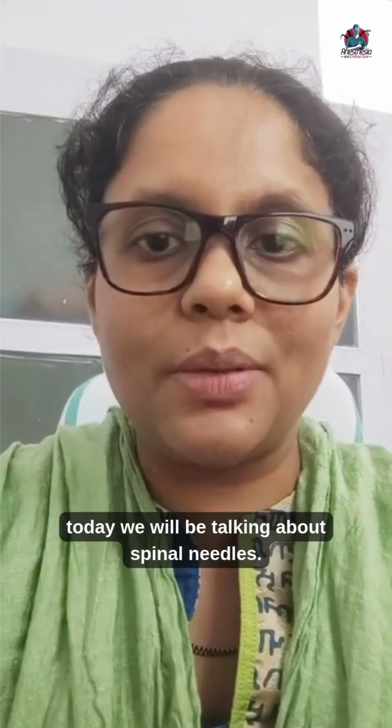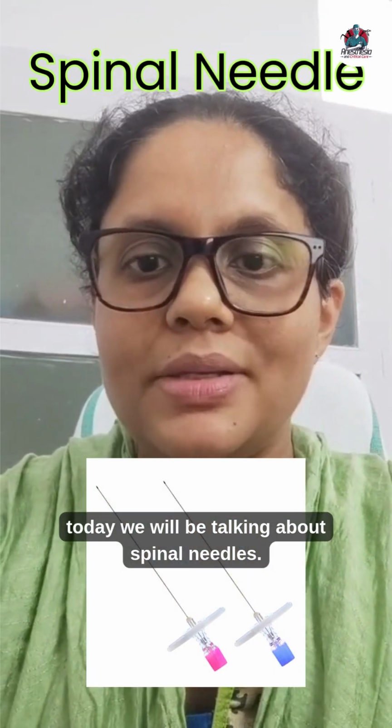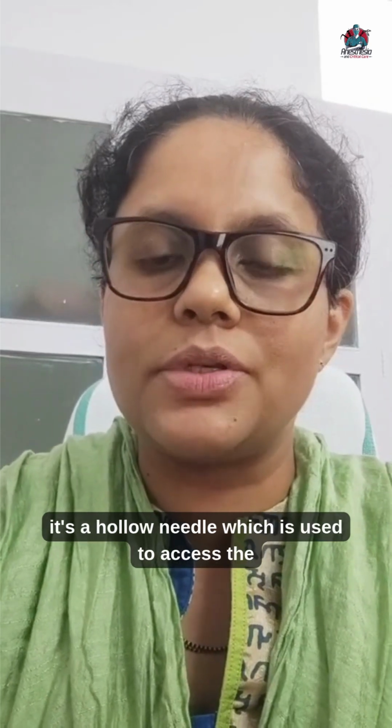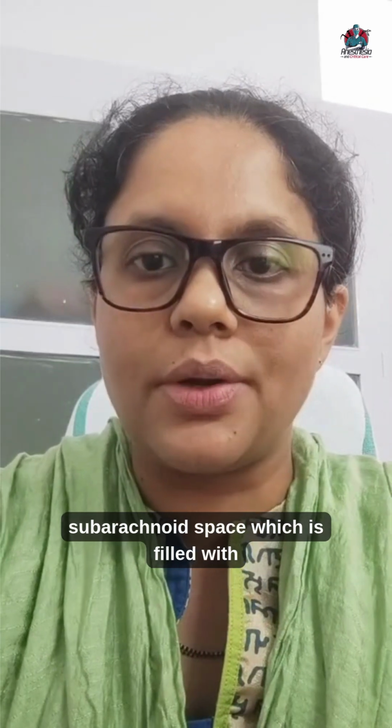Good morning. Today we'll be talking about spinal needles. Spinal needle definition: it's a hollow needle which is used to access the subarachnoid space, which is filled with CSF.